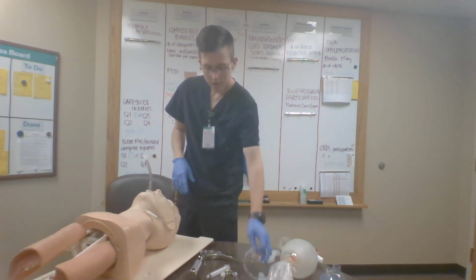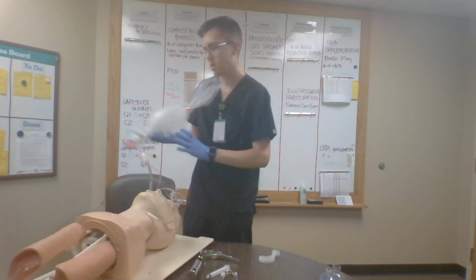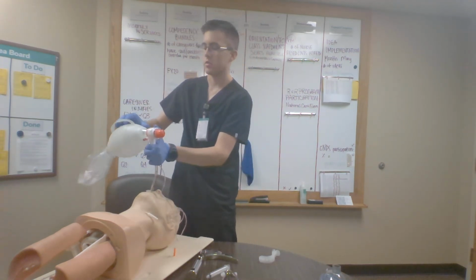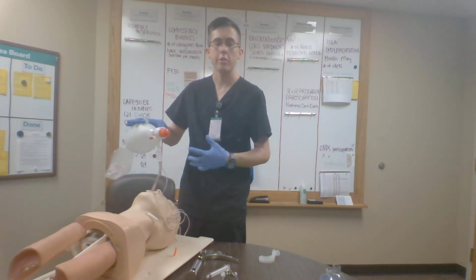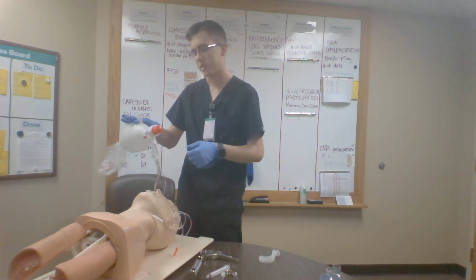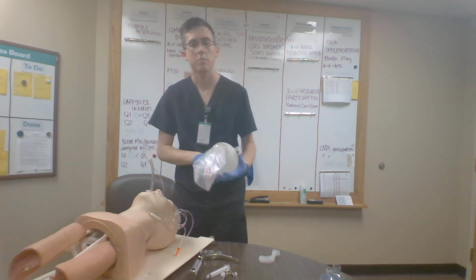I want to reconfirm tube placement and continue to go back and ventilate my patient 10 to 12 times a minute, noting for signs of hypoxia as well as monitoring their SpO2 and capno, and then evaluating for any changes in patient condition.